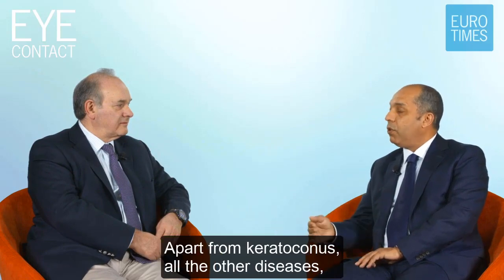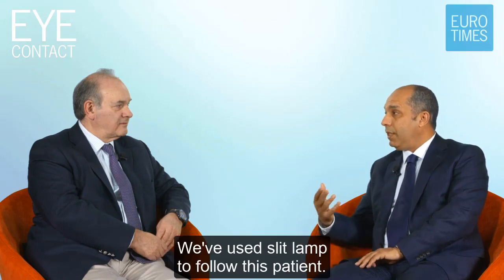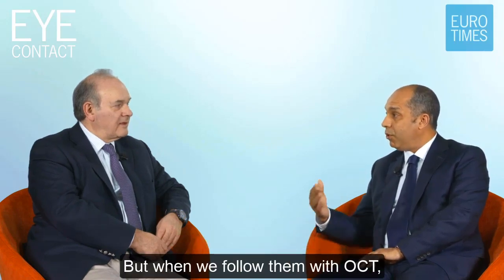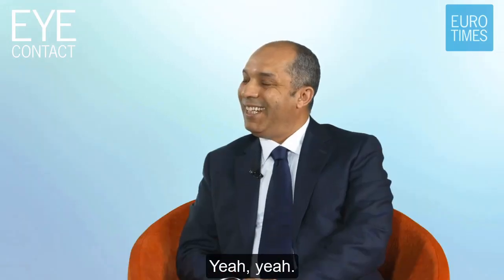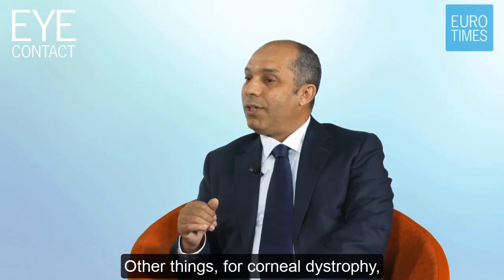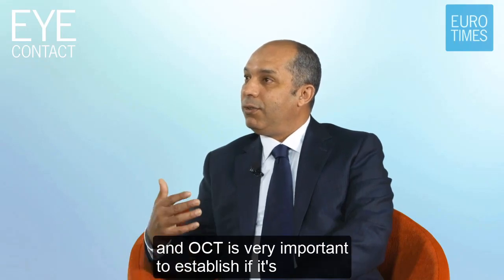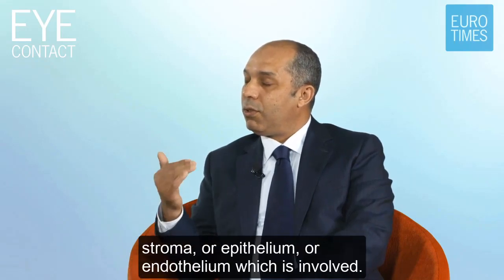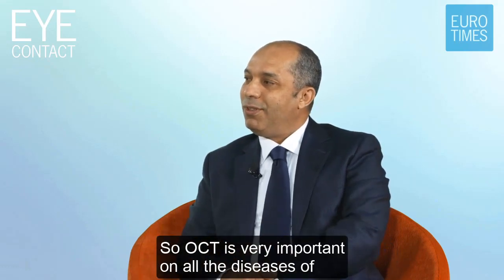Apart from keratoconus, all the other diseases can be checked by OCT. Let's take some other examples. For example, for corneal ulcer, we use slit lamp to follow this patient, but when we follow them with OCT, it's very easy to know if we are progressing or not. Other things, for corneal dystrophy, congenital corneal dystrophy, we know the new classification, and OCT is very important to establish if it's stroma or epithelium or endothelium which is involved. So OCT is very important in all the diseases of the cornea.